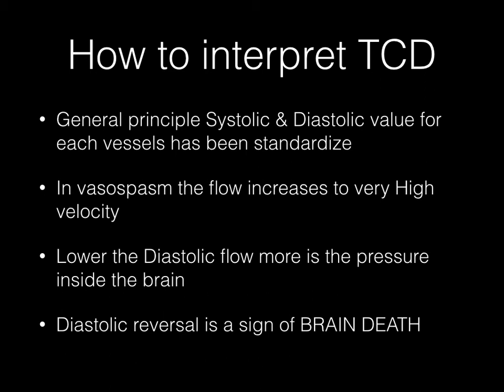All right. So there is a caveat to it. You have to learn over the course of time. When you get better at transcranial Doppler, you will see all these variations. For simple terms, it's basically diastolic low is bad and systolic very high is bad, and diastolic reversal towards the negative happens in brain dead patients. Okay, diastolic reversal is a sign of brain death.